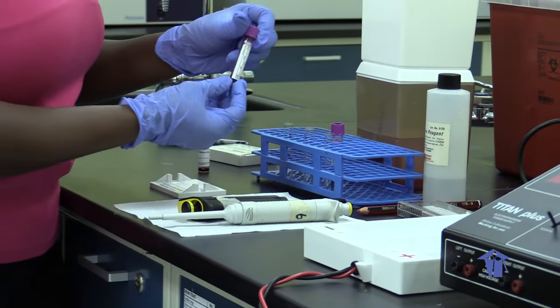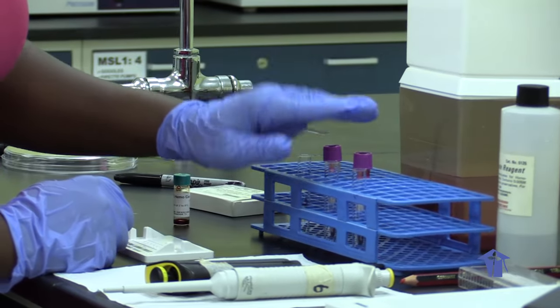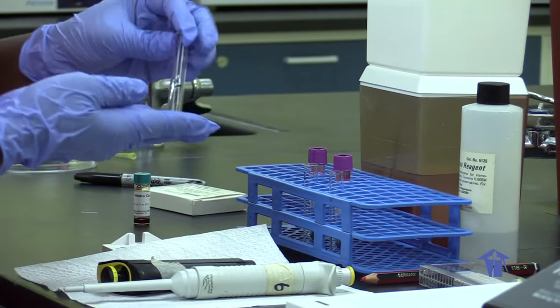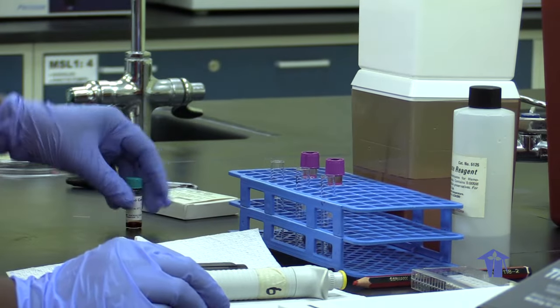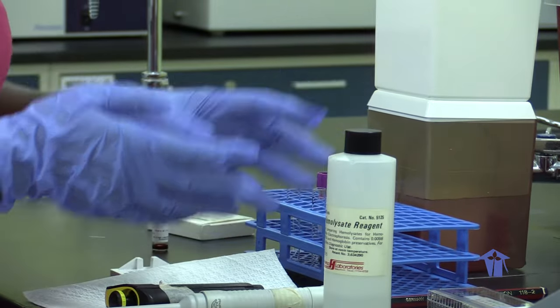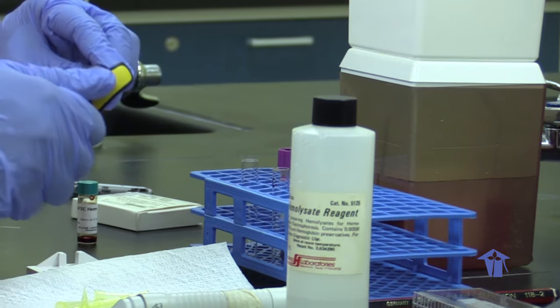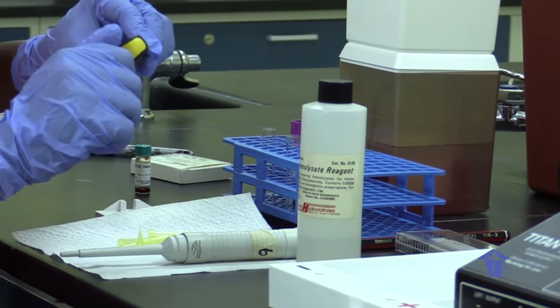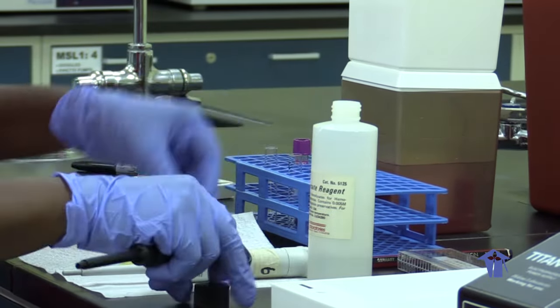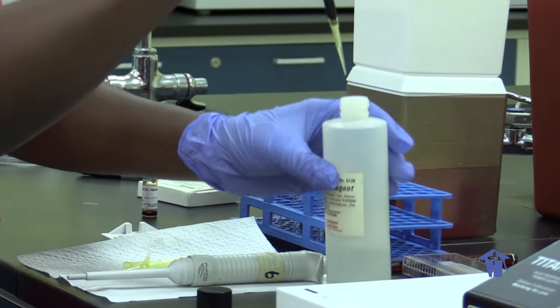So now we have our whole blood samples. Again, we're using whole blood. Then we have our tubes. These tubes are basically to do the lysing, as I spoke about before, to release the hemoglobin from the red blood cells using our hemolysate reagent. The dilution is basically 1 part whole blood to 3 parts hemolysate. So we're going to use 75 microliters of the hemolysate reagent to 25 microliters of the blood sample.